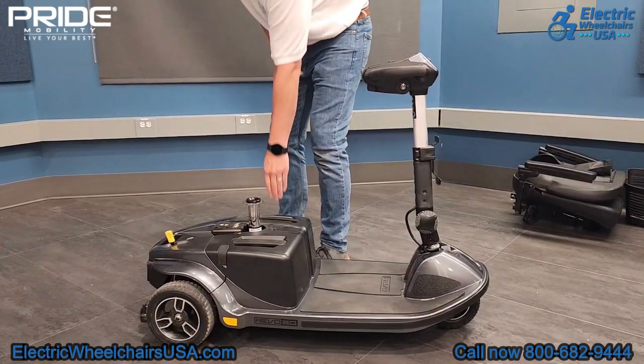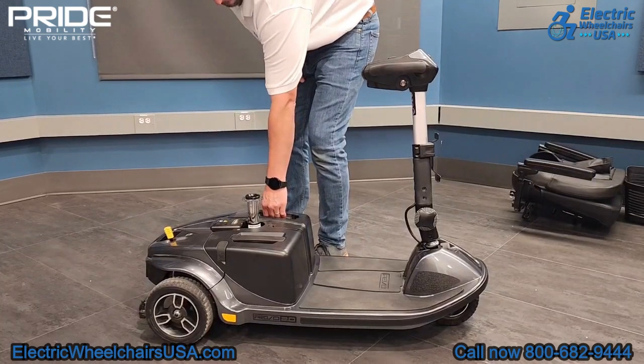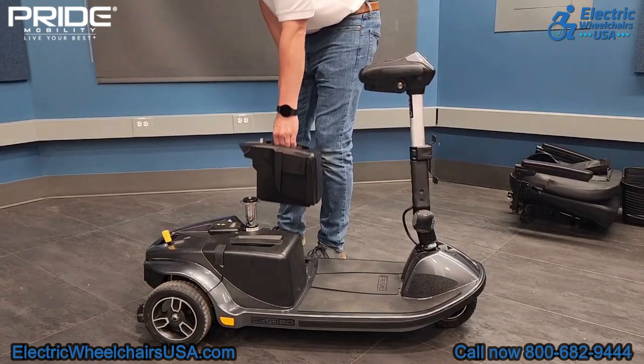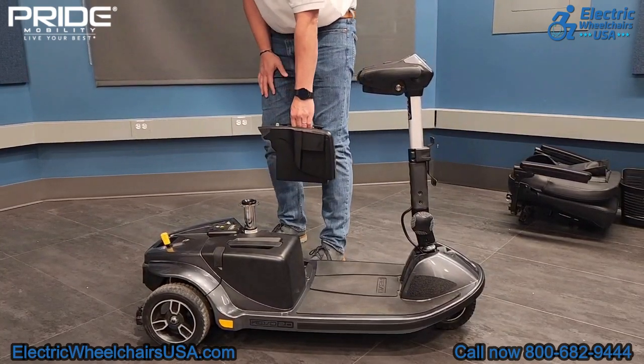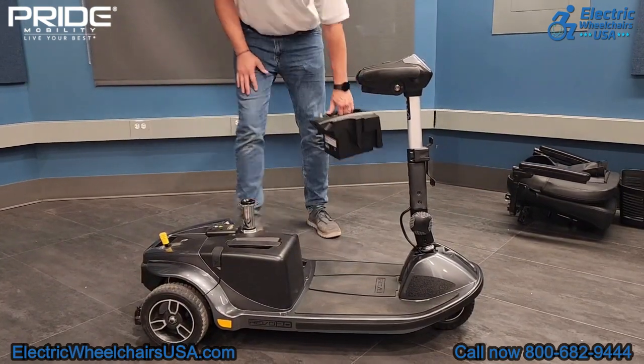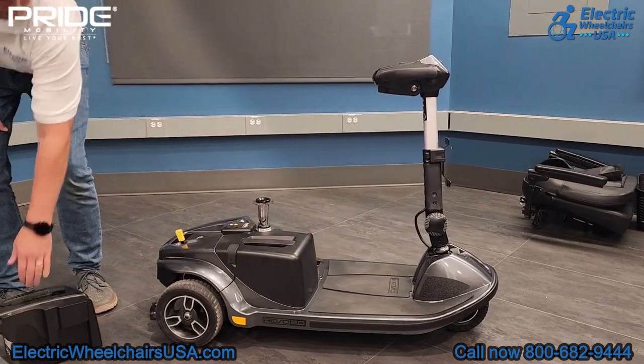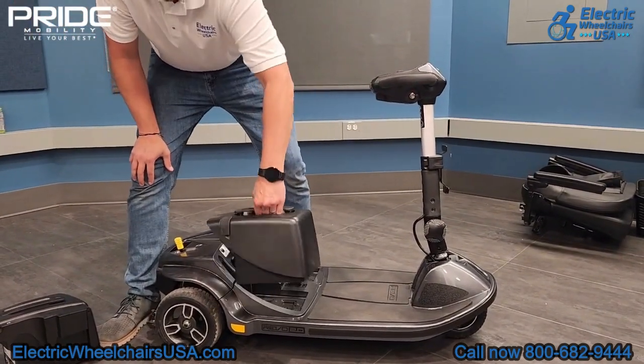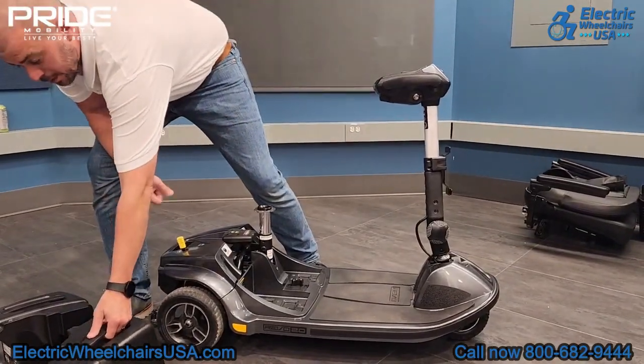So a lot of portable scooters have 2 batteries and 1 battery pack. The Revo has a battery and 2 battery packs. So there's 1 battery in each of these battery packs. So if you're sitting on the seat, you would remove the one on the left side first, and then the one on the right side, remove that one second, and they lift straight off.